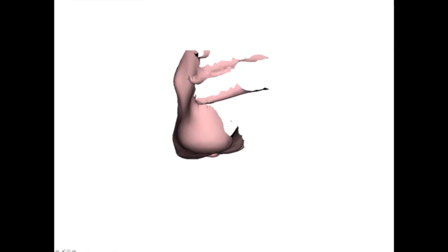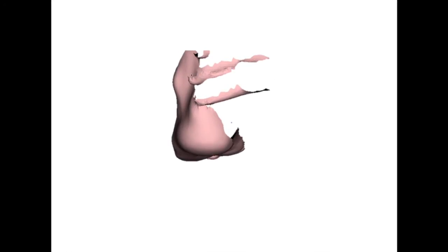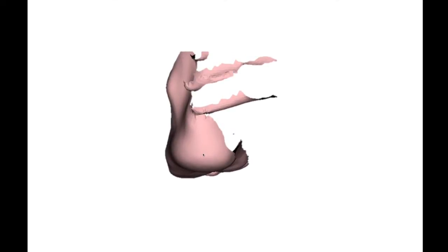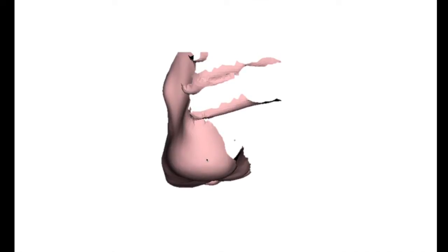Now a fairly common issue is where the podiatrist's fingers are also captured in the image and in this image you can see they're well out of the way. However, sometimes people's fingers are being captured in the usable parts of the image where the orthotic will contour the foot.